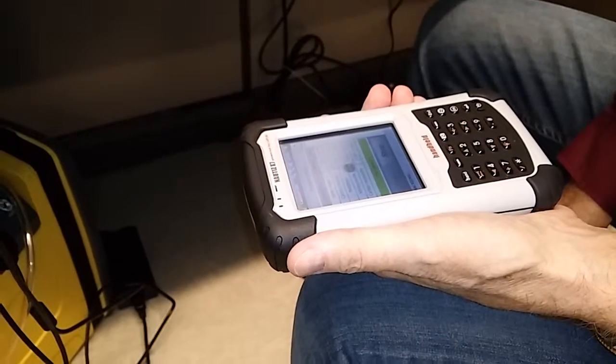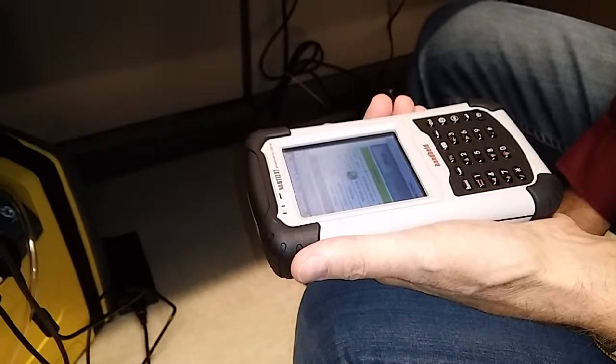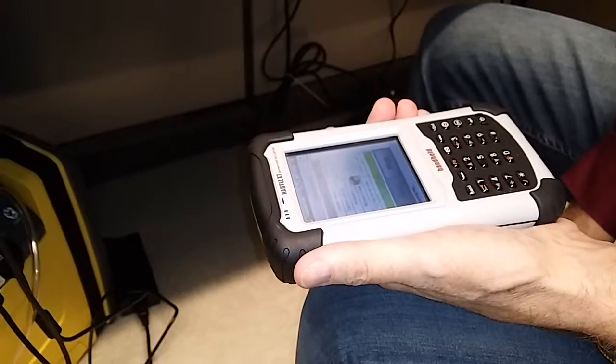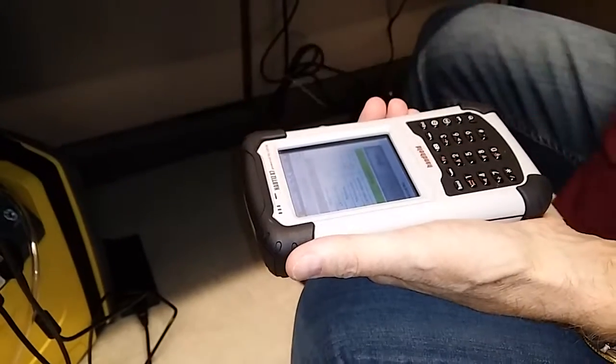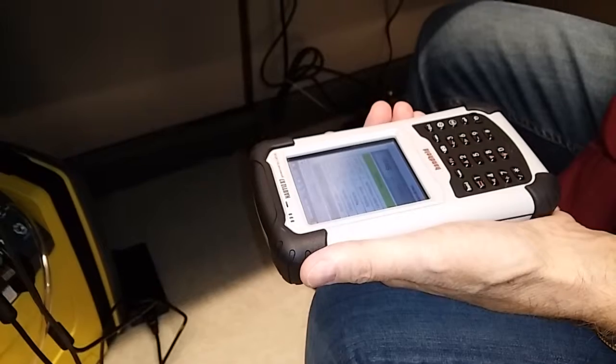So now it'll change as we keep on breathing. It should go up, because normally outside it's around 400. Oh, now we're up to 400. So maybe the cell wasn't purged, and maybe that was the problem when we were running it through before.